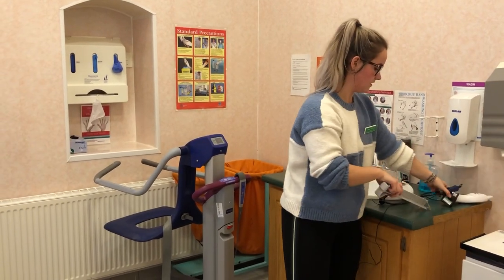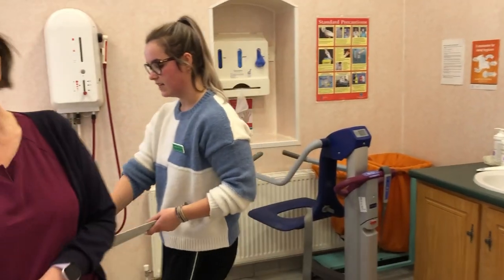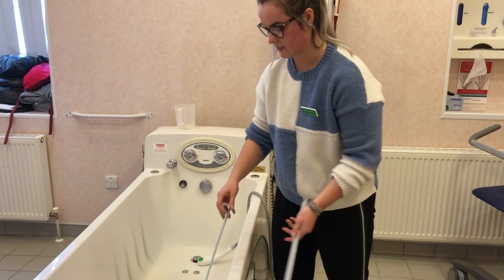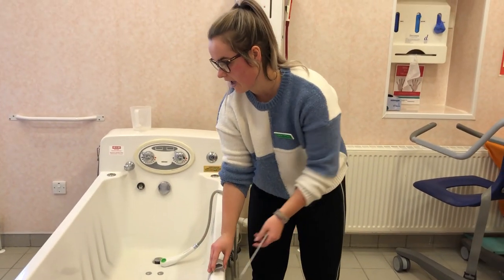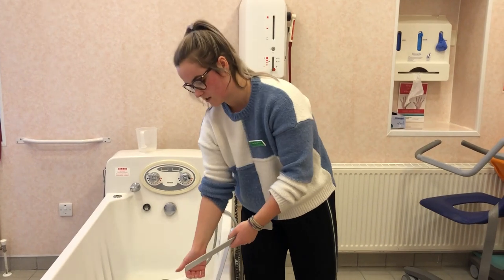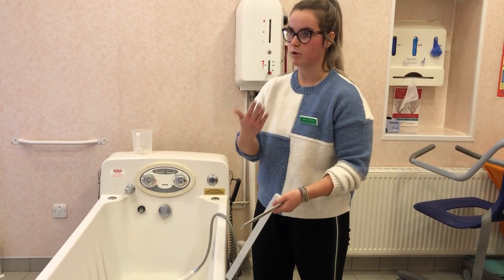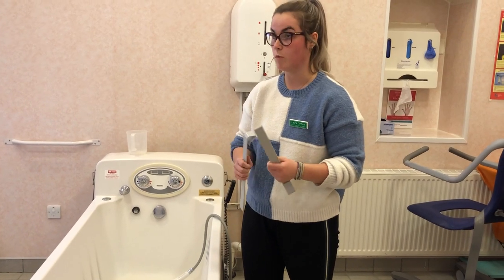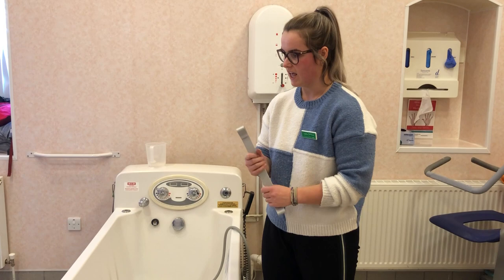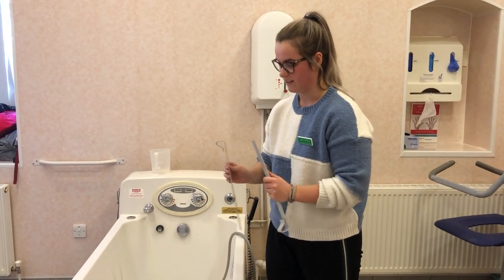These accessories also come with the bath aid. If your bath has integral rails, you put these on so that the edges of the seat don't get stuck. If they got stuck in the integral rails, the motor will keep trying to push up and won't shut off, which will ruin the motor and break the whole unit. So make sure to use these if your bath has integral rails.